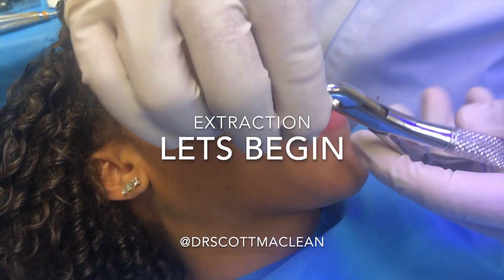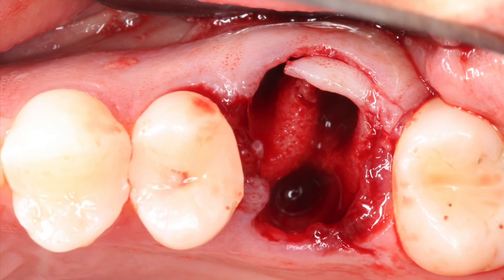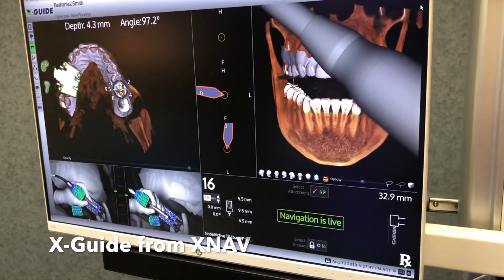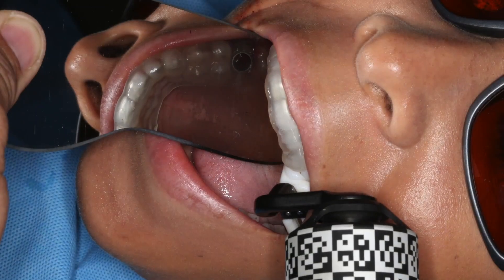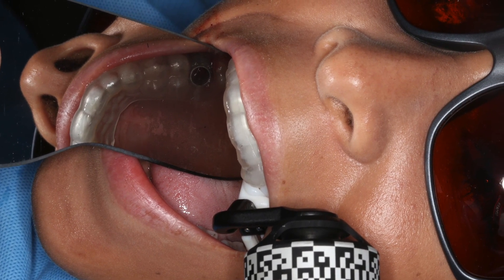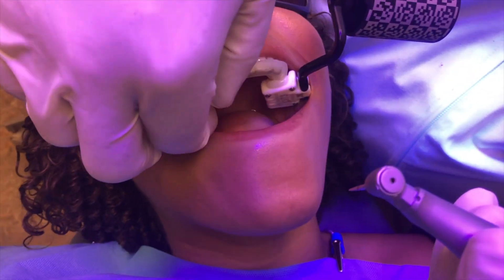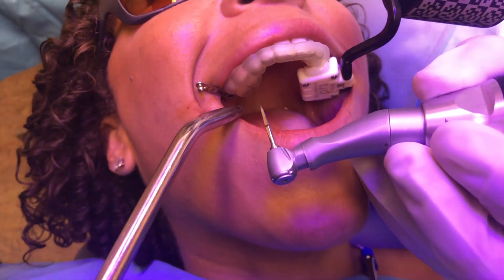Let's begin. We'll take the tooth out — we've extracted a molar that's been fractured, as indicated by the probing depths on the facial. We can see it's a nice site, so we'll cleanse it and get that ready. We're actually going to be penetrating the base of the socket, which is the base of the sinus, just to engage the tip of the implant. You can see as we get this positioned, the template is in place and the clip is also in position at the same time. Two navigation systems are occurring here simultaneously.